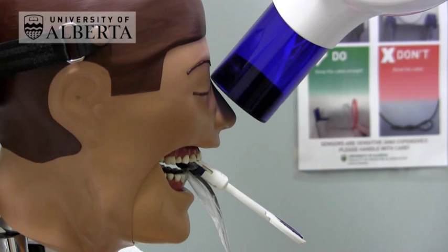If the teeth have very long roots, you may need to further increase the vertical angulation in order to see 2-3mm around the periapical area.